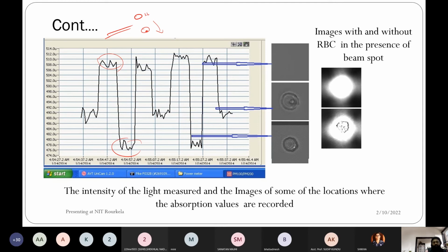For reconfirming and rechecking purposes we have done it multiple times, and it is evident from various other studies too. When red blood cells, RBCs, are affected by malaria, the malaria parasite present inside consumes the hemoglobin content in the RBC. The parasite consumes it, survives inside, and tries to multiply inside the RBC.